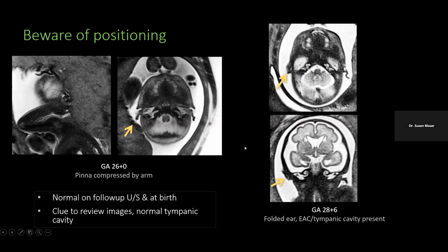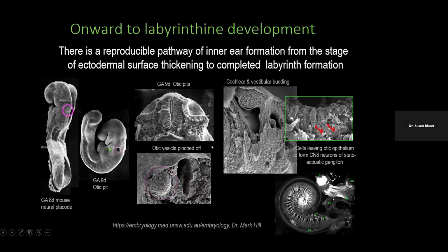And also, when we called and said there was a possible microtia, our ultrasonographer said to look again because they didn't see that particular finding. Yes, there are abnormalities of the brain as well as prominent pericerebral fluid spaces. And I believe that that particular fetus had CMV.